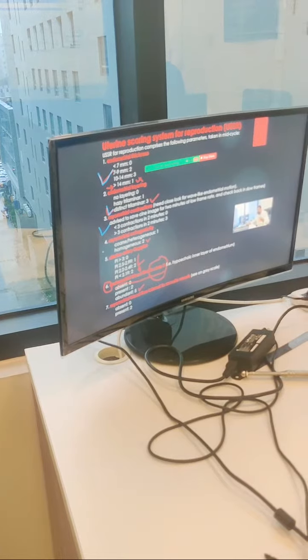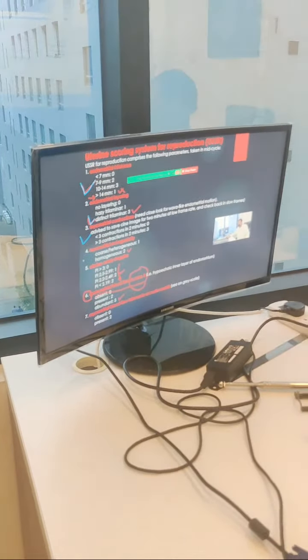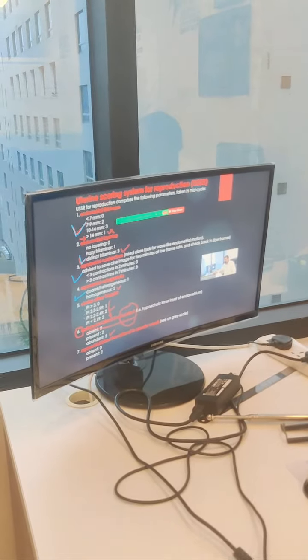So, have a look at endometrial thickness, see for the endometrial layering, see for the myometrial contraction, see for the myometrial echogenicity itself. Because if it is heterogeneous, there will be a drop. And if it is homogeneous, then I will give you the sufficient marks. I mean the points.